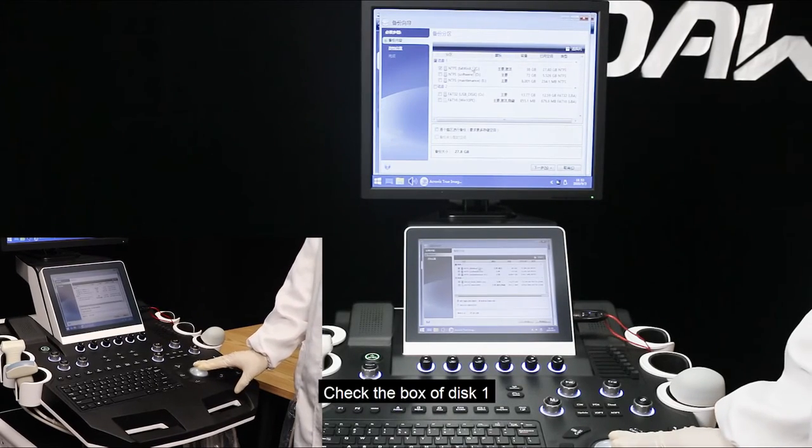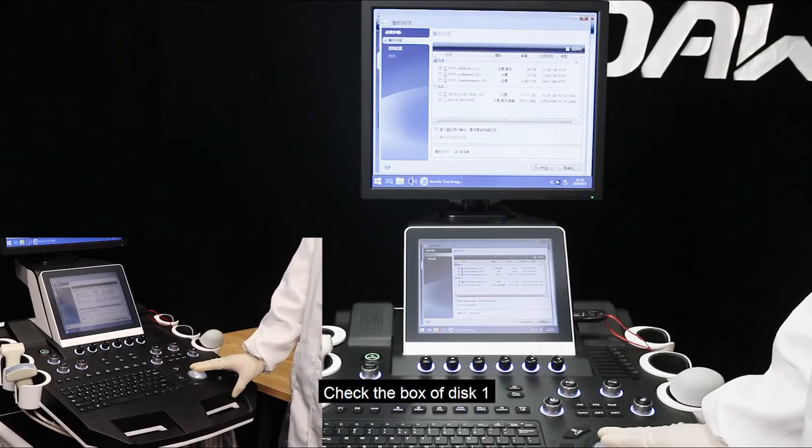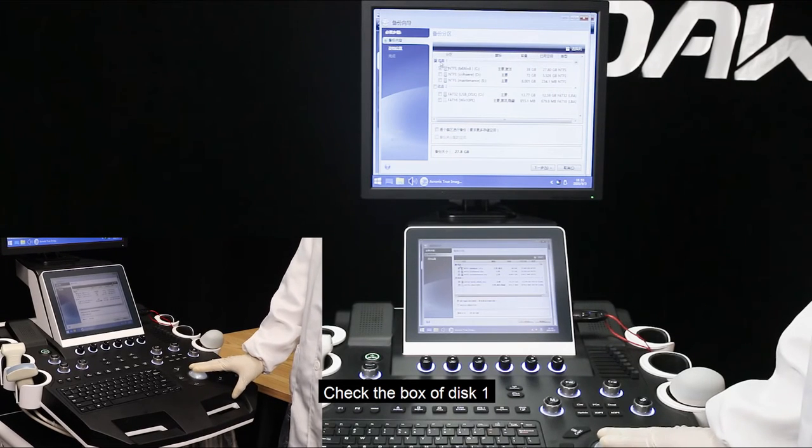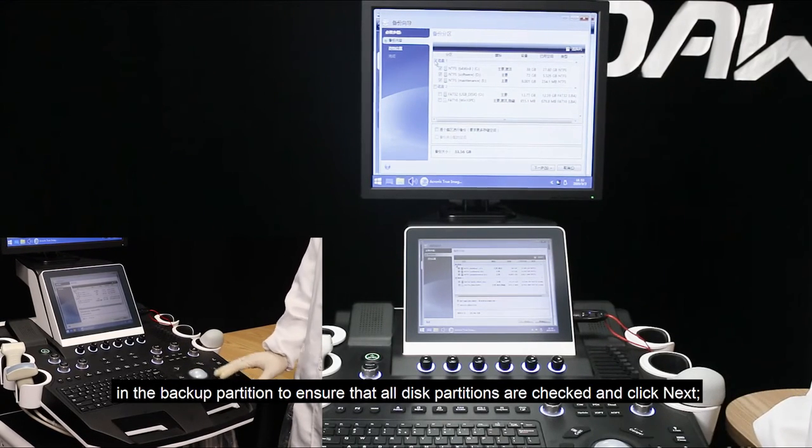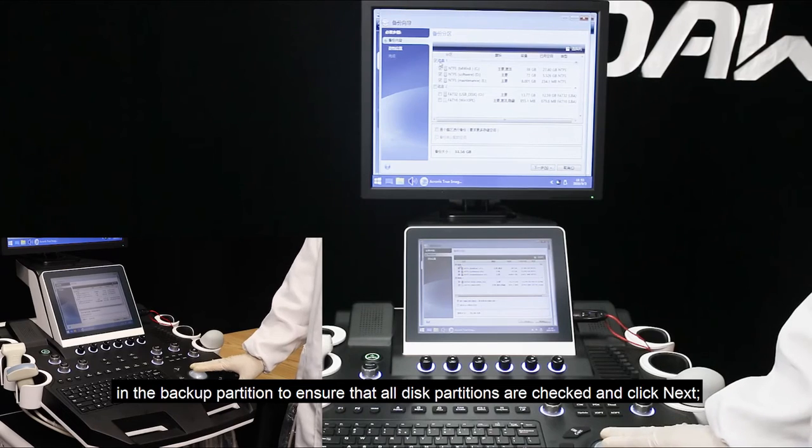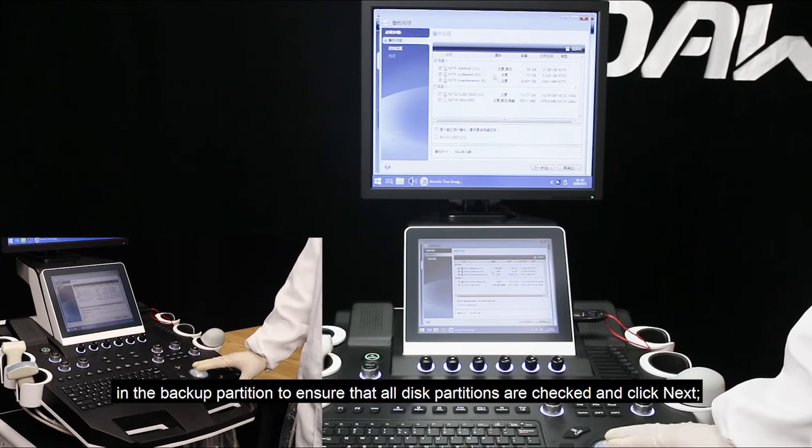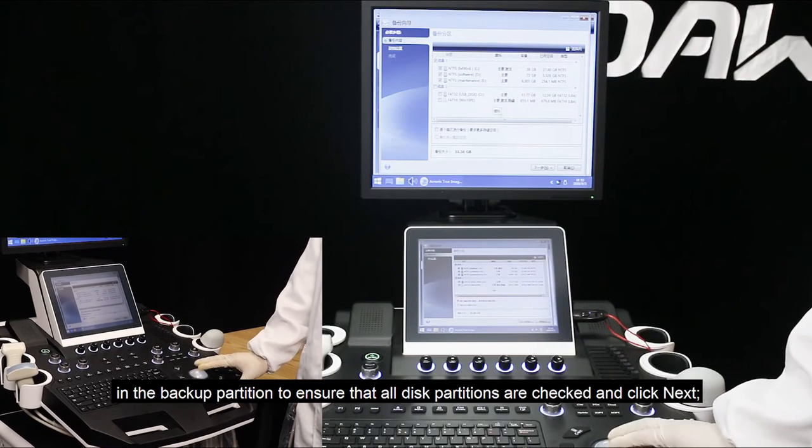Check the box of disk 1 in the backup partition to ensure that all disk partitions are checked and click next.